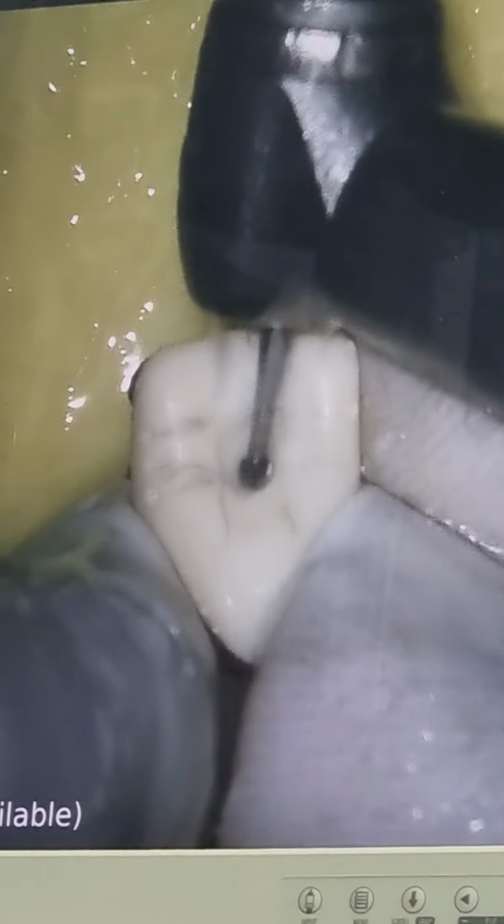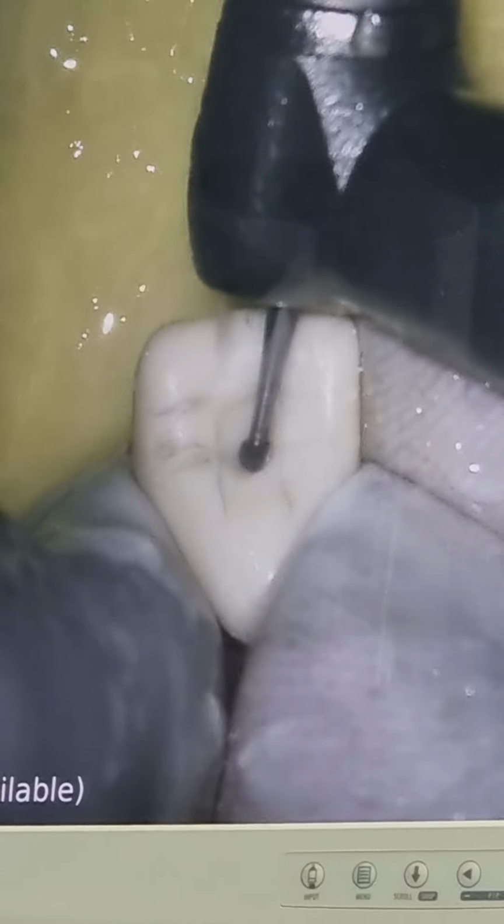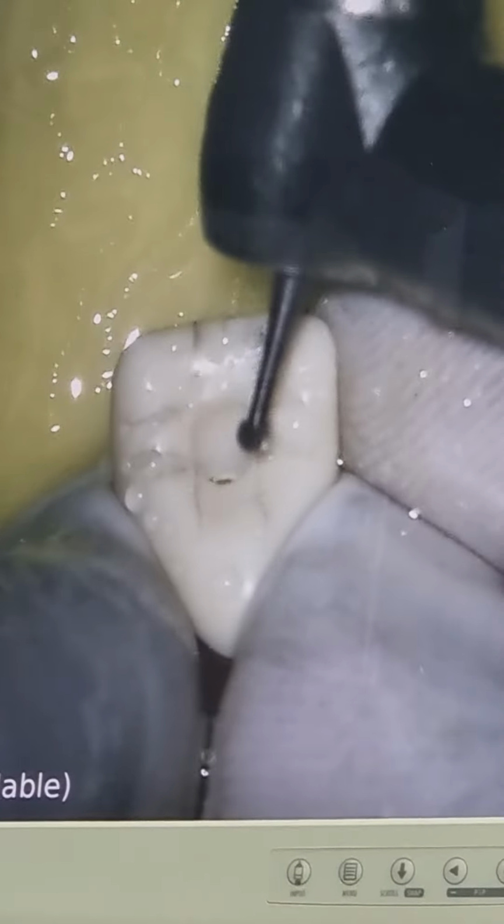This is the old bur, so it's not cutting as fast as it should. Now I'm going from enamel to dentine, and then finally I will reach the pulp.